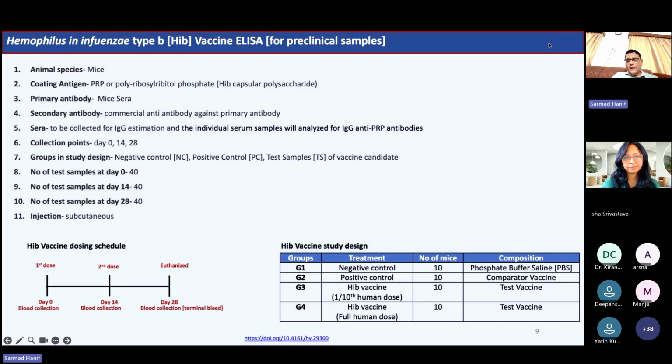Yes, plant-based therapy, I think you can use, but I'll be specific. Generally in ELISA, what you estimate is the concentration of a protein, which can be the antigen, or a specific biomarker related to that particular kind of disease, where you have these biomarkers as proteins.